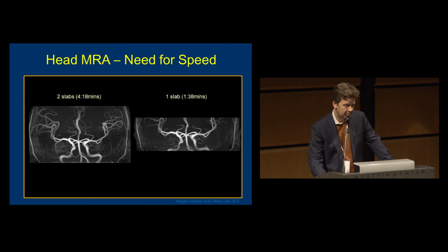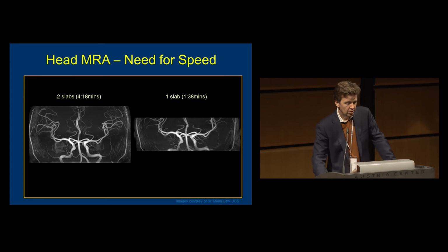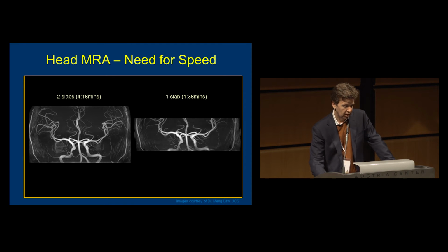This is the additional contrast that Toshiba provides, which is the hybrid of opposite contrast, or HOP MRA, which is a combination of TOF and the FSBB. And notice that compared to the standard TOF, there's increased visibility of slower vessels, slower flow in branches that are more distal, and you start to see a lot more of these M2 and M3 branches, for example, compared to the standard TOF.